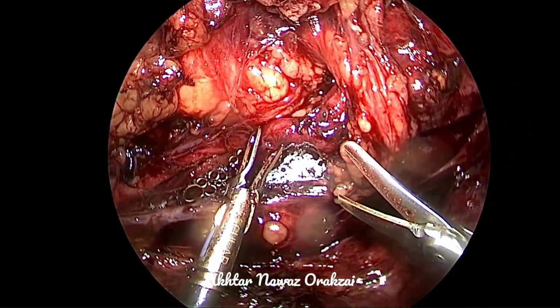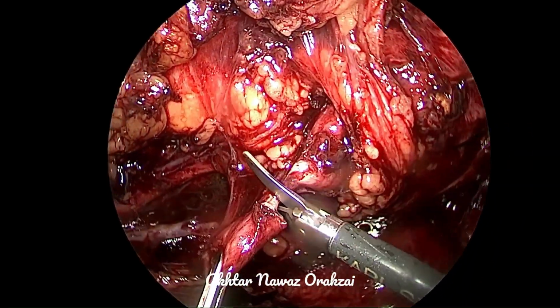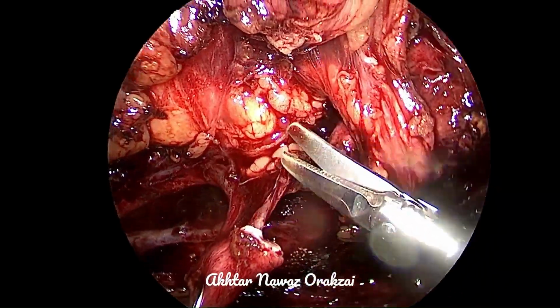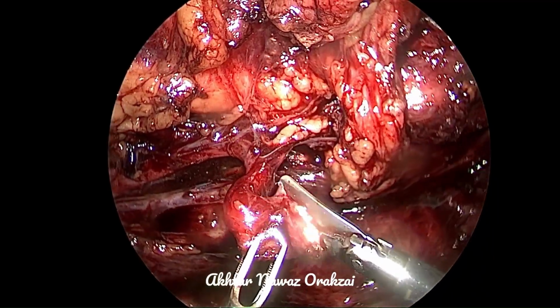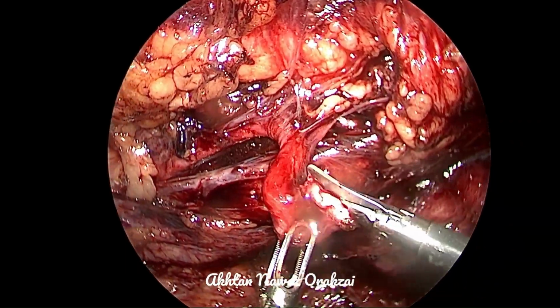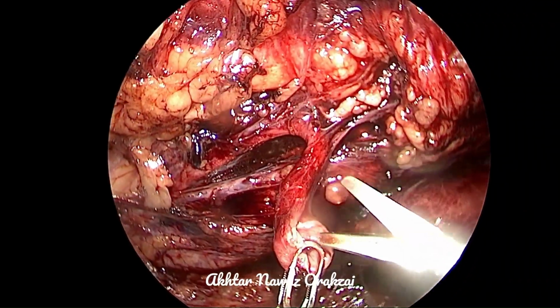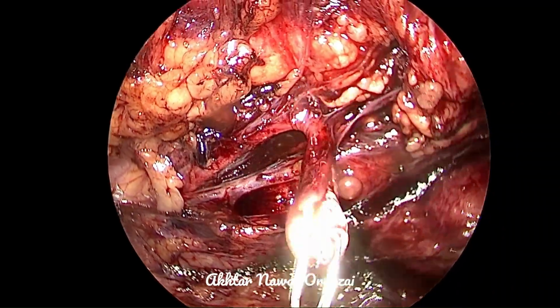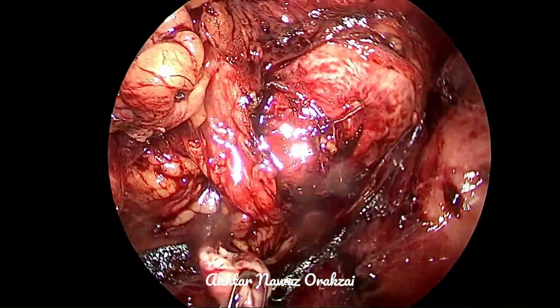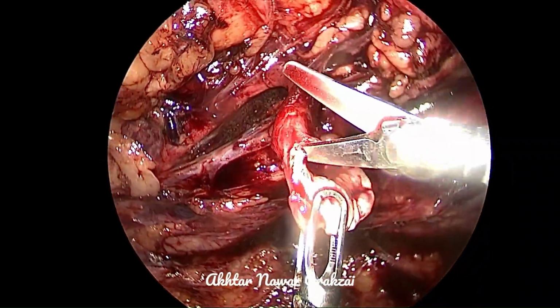Now, after enough mobilization, we are dismembering the ureter from the pelvis. Here there is some tissue along the ureter, so spatulation is performed. We need to spatulate it enough that here you can see that it is coming to the pelvis without any tension.